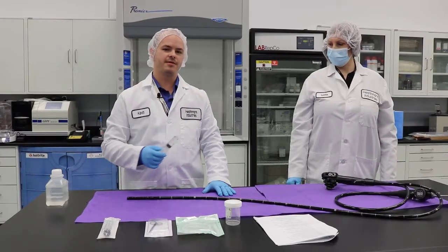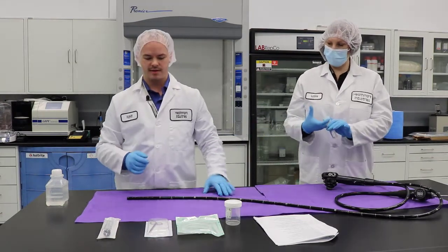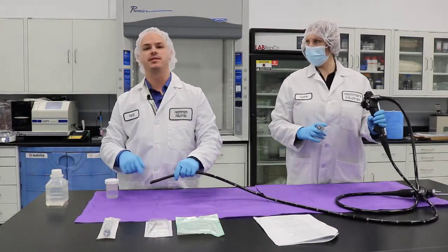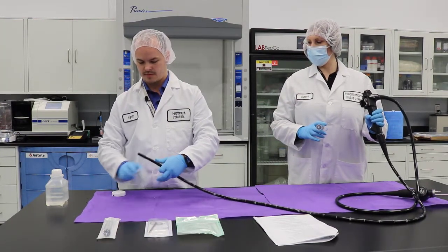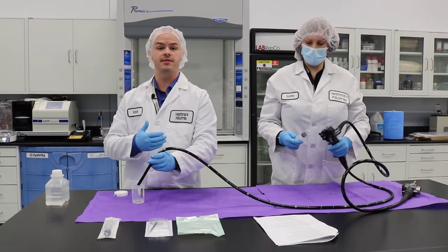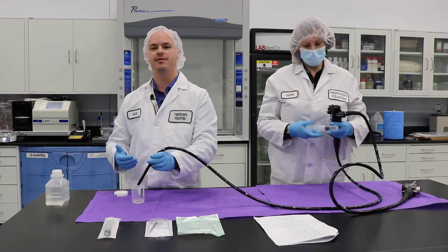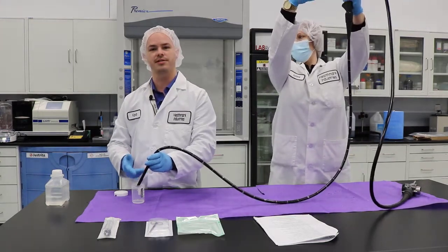Our facilitator is going to take the water that we extracted and move to the other side. I'm going to prepare the distal end for when she pushes the sterile water through the endoscope. After she pushes the sterile water through, she's going to draw back on the syringe and push air through the endoscope in order to push the rest of that fluid through into our collection container.